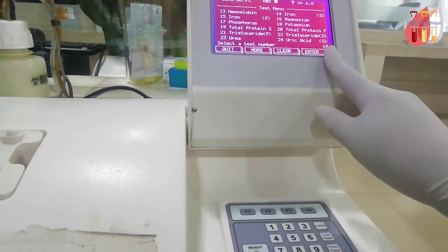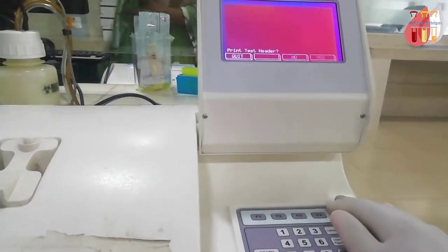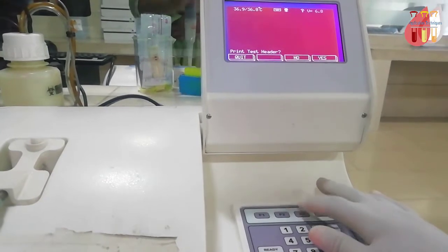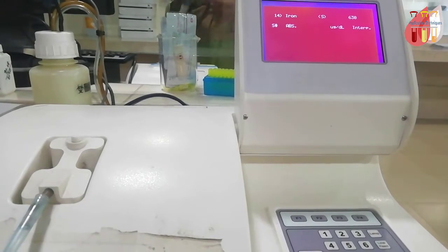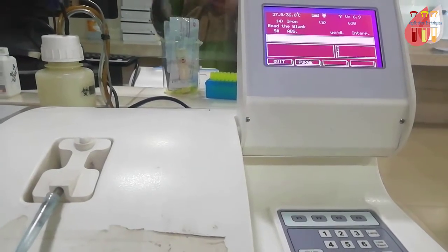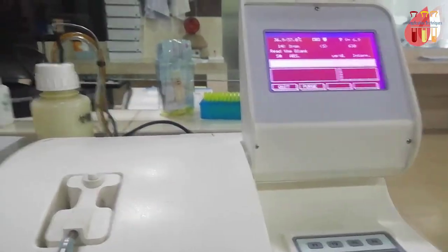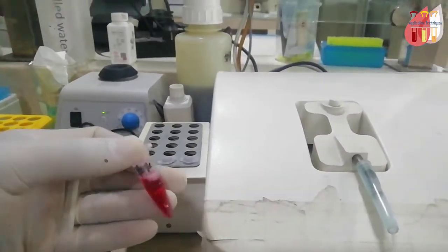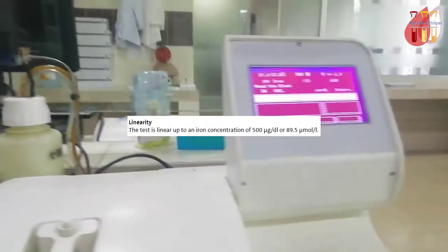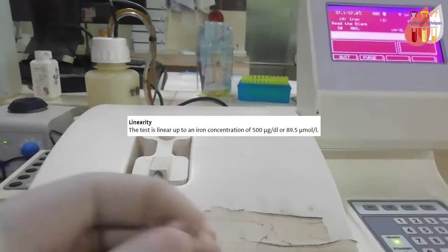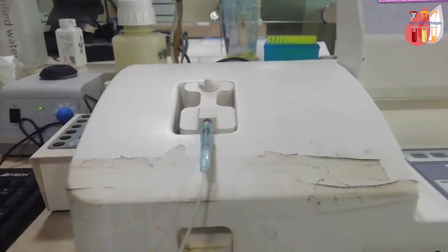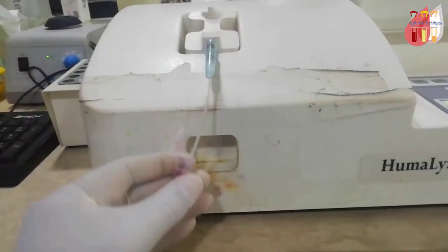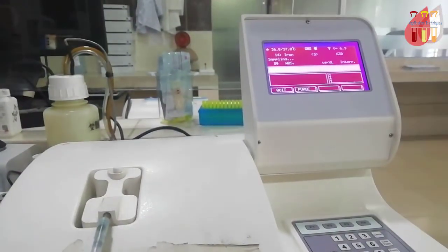First, set the program on the semi-auto biochemistry analyzer with wavelength filter 546nm, standard 100 micrograms per deciliter, normal range for male 69-178 and female 36-154 micrograms per deciliter.